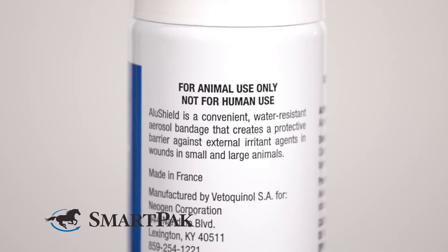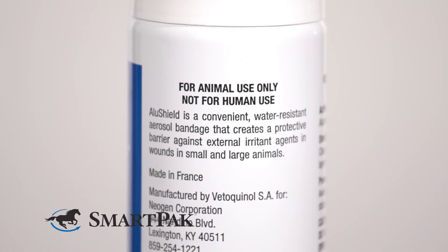I went through a lot of this product when my horse suffered a laceration that required stitches on one of her hind legs. Although her wound required bandaging at first, this was the perfect choice to help transition her to leaving it open for further healing.